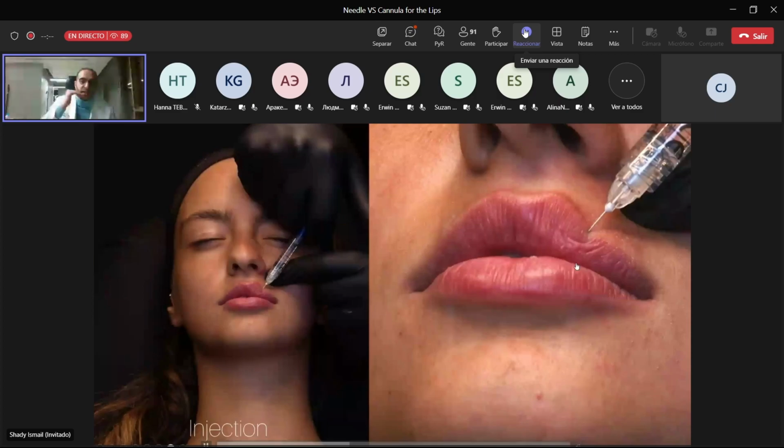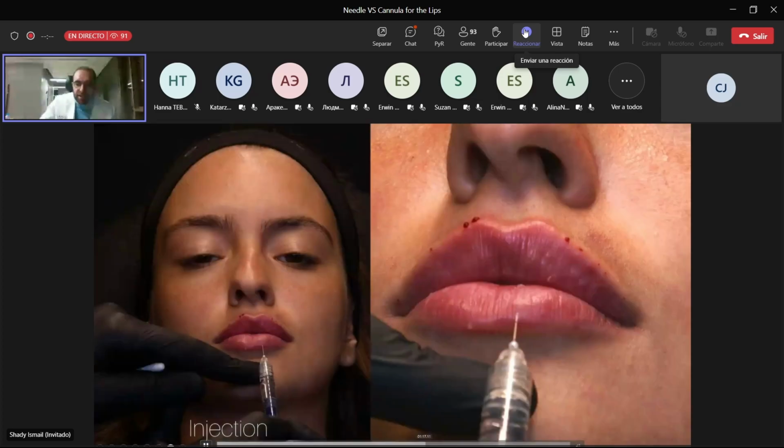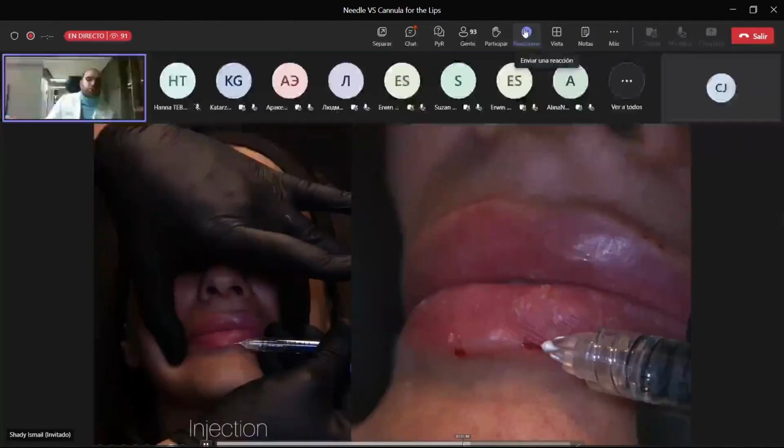I'm using the needle gently all the way to improve the lip, and we can see an immediate difference between both sides, and then I injected to improve the cupid bow. Also, with the same technique in the lower lip, I inject the two tubercles paramedian, and then I can enhance the symmetry. Then here, I'm just smoothing out the lines and the wrinkles of the lip itself. You can see here a keyhole out.